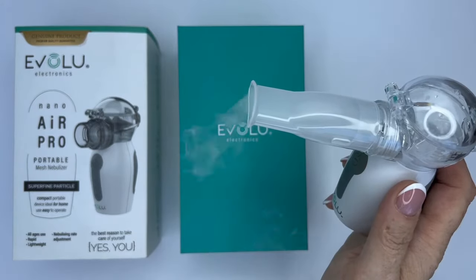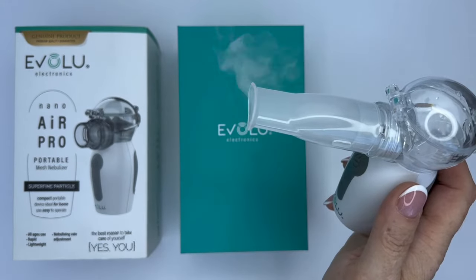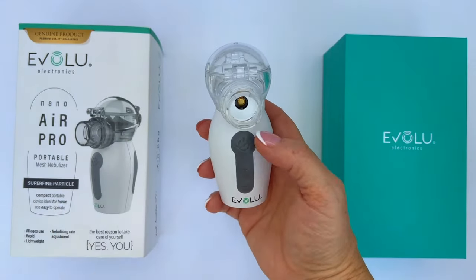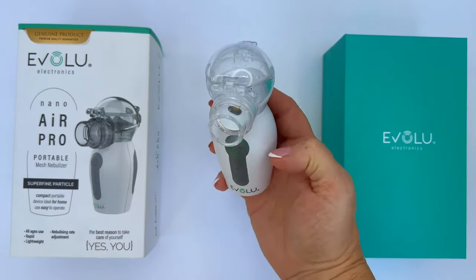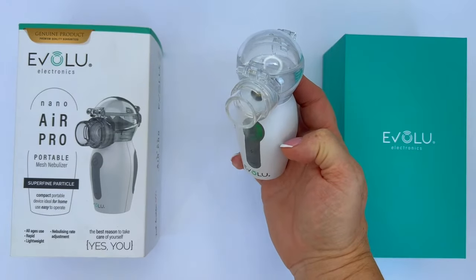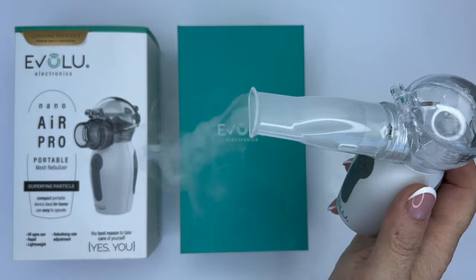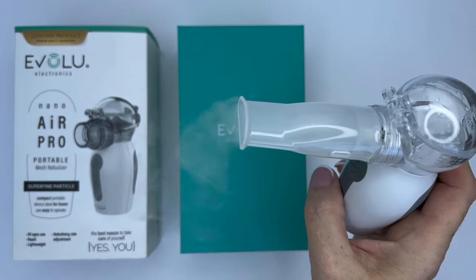Once fully charged, the inhaler can run for up to 60 minutes. To switch on the device, press the button in front until it turns green. The inhalation process itself lasts for 10 minutes. After 10 minutes, it will automatically stop and the device will switch off.